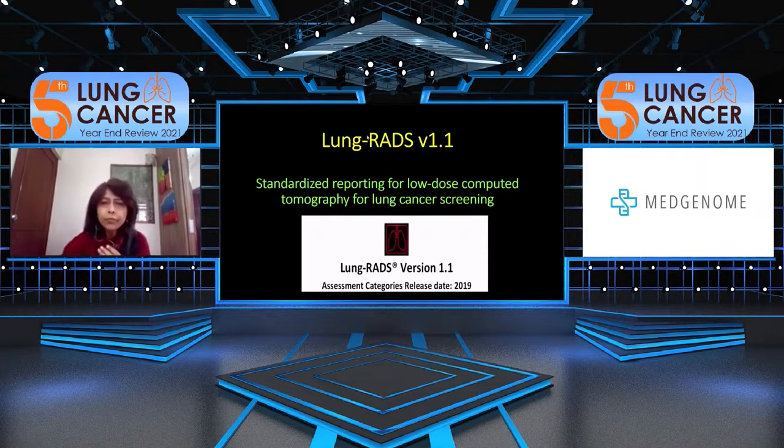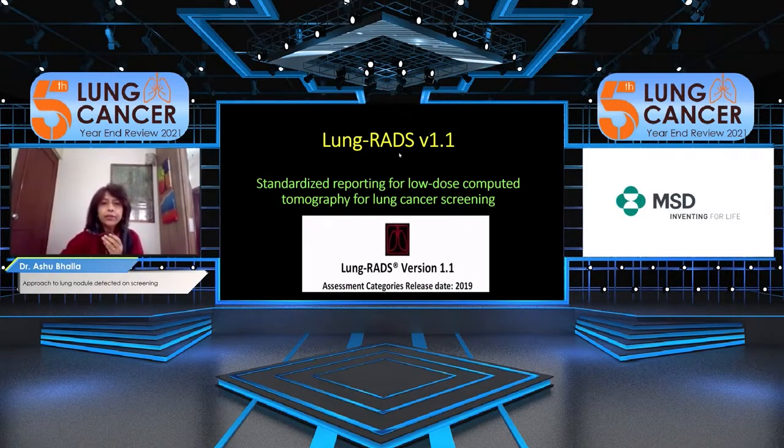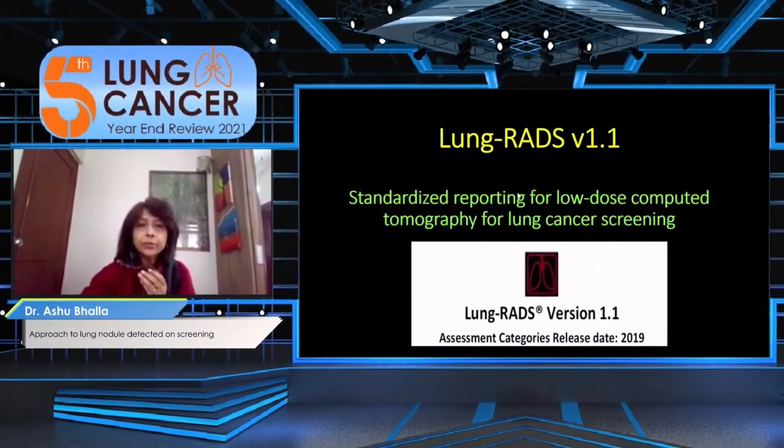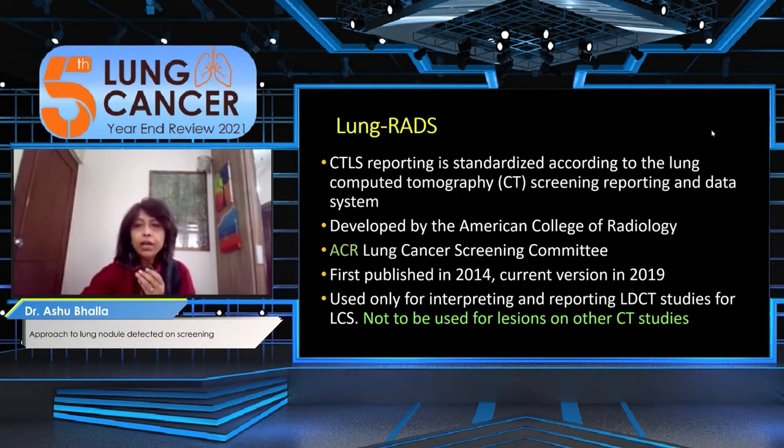Just like we have RADS guidelines everywhere, we have similar RADS guidelines for reporting the screening CT scans which are done under the LCS programs. Currently, we are supposed to follow version 1.1. The first version came out in 2014 and 1.1 came out in 2019. Since we are discussing incidentally detected nodules, I will clarify this issue later, just to say that Lung-RADS as such cannot be applied to any nodules outside of an LCS setting.